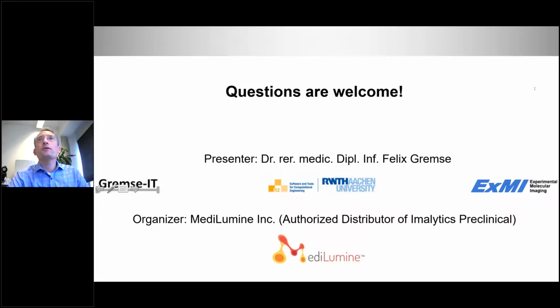There's a question from Dr. Susanetto about root canals. So I guess that's from teeth, and probably you work on microCTs to scan teeth. And yes, you can make such measurements. You can measure the area or the surface of such root canals. And you can measure some features like density or these morphologic features. Yeah, I think that would work. There's a form factor, for example, for roundness. Porosity is not supported yet, but I might add that if that's interesting.